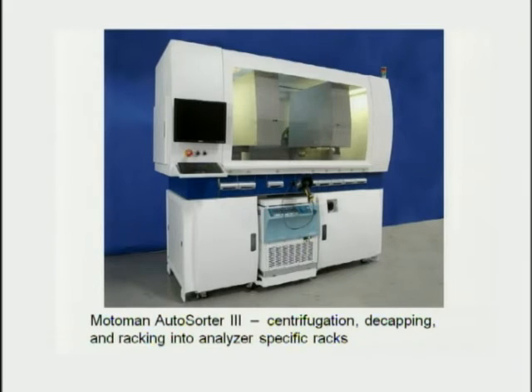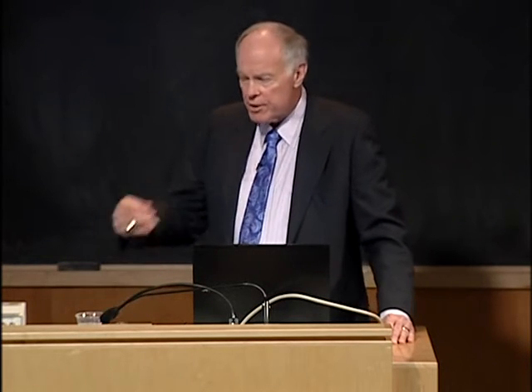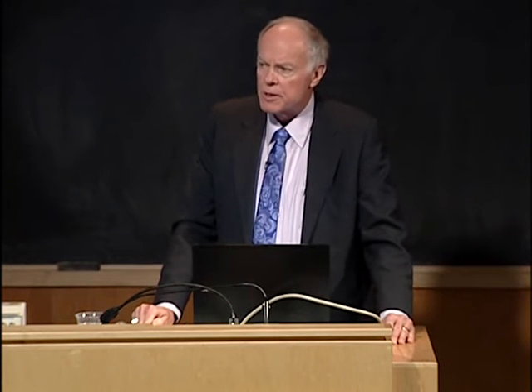There are two different robots operating on the deck of this, both of which are Cartesian-type robots, so they go in two dimensions. And so it's very fast, and basically its throughput is the same speed as the centrifuge. So whatever you set the centrifuge to, if you're going to try to do 6 runs per hour or 5 runs per hour, the centrifuge buckets hold 24 tubes each. And so its throughput is somewhere on the order of 550 specimens per hour.